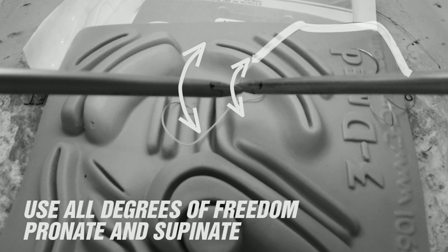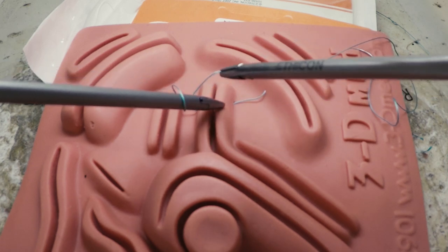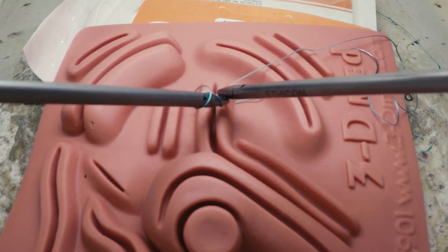If you gathered the suture above the equator, as we have here, your tying instrument should begin tying the knot by going below the loop. This avoids the potential complication of trapping the needle end of your suture within the knot. Working directly over the knot also increases your length of working suture.